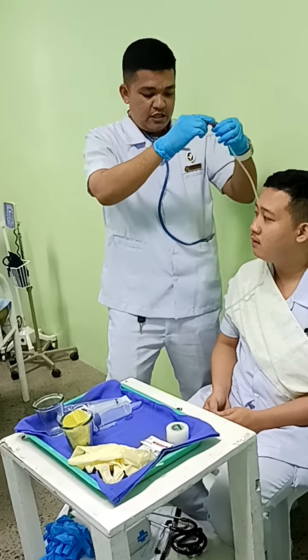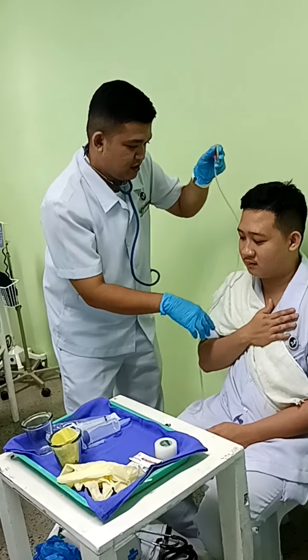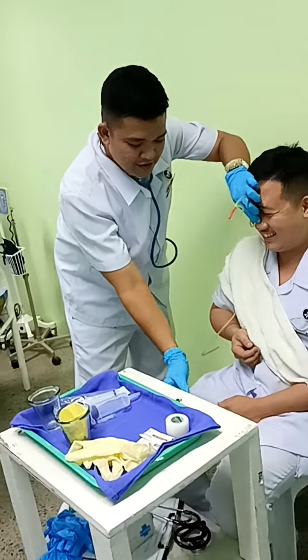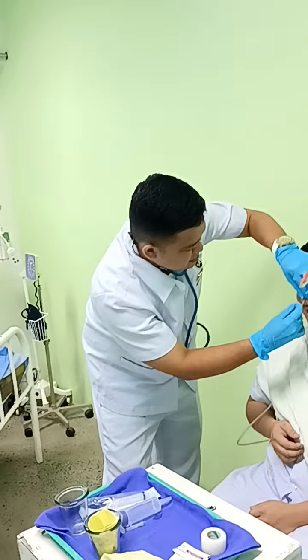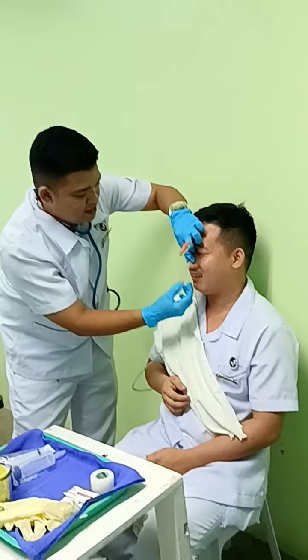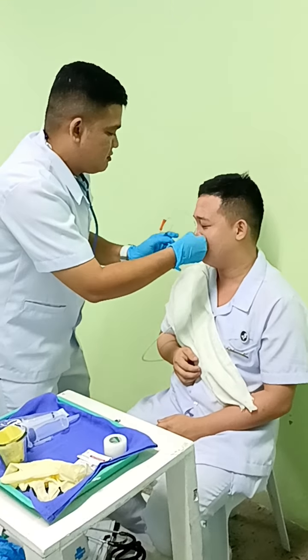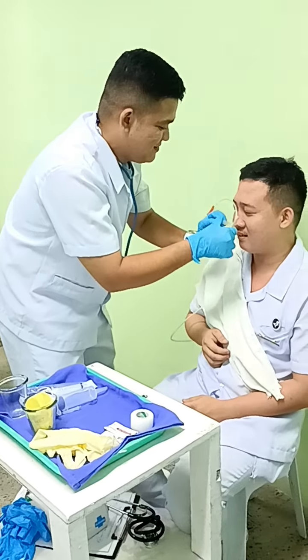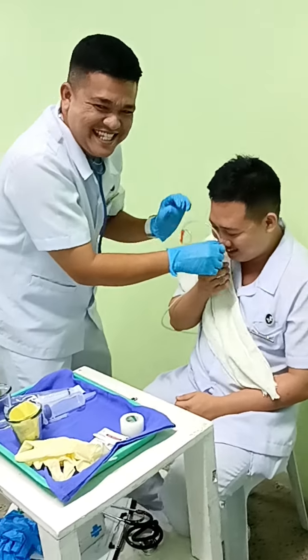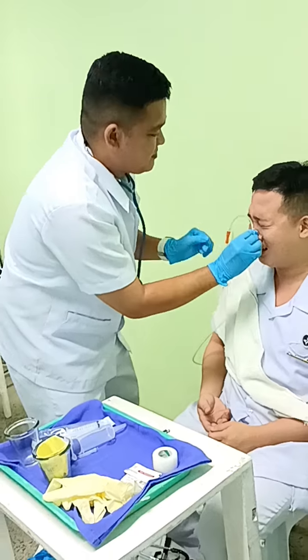After auscultating, we're going to obtain baseline data, including the laboratory values, as well as to determine whether the patient is having any abnormalities. Then we're going to verify the physician's order about the procedure, and then we're going to explain the procedure to the patient, then prepare the materials needed. Then we're going to position the patient in a high Fowler's position, and then we're going to wear gloves and perform hand washing.